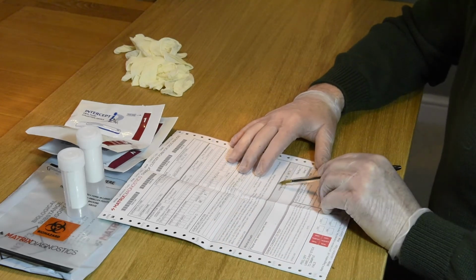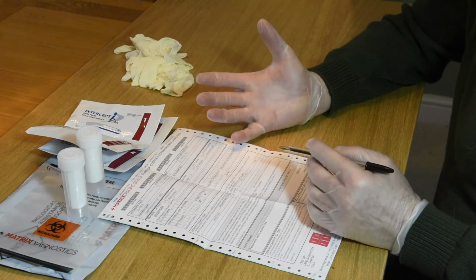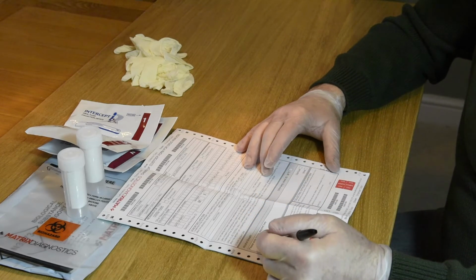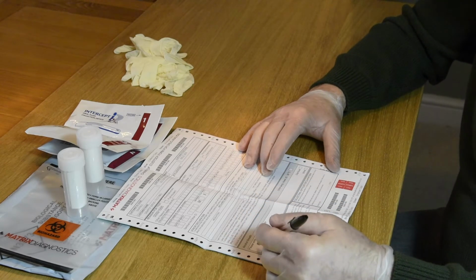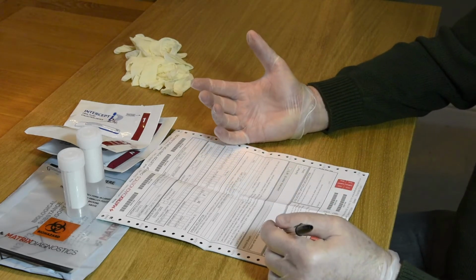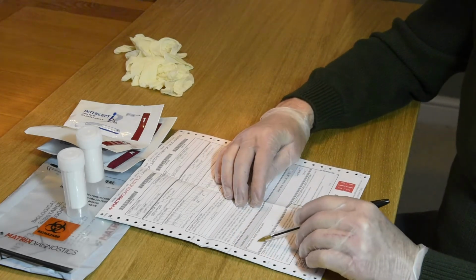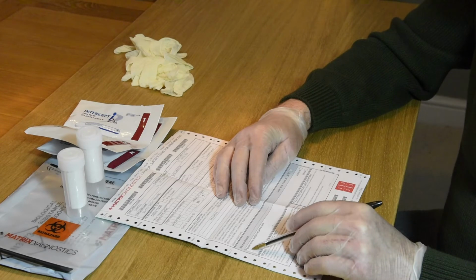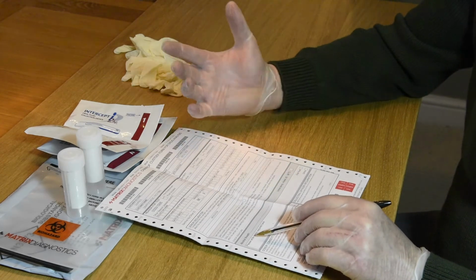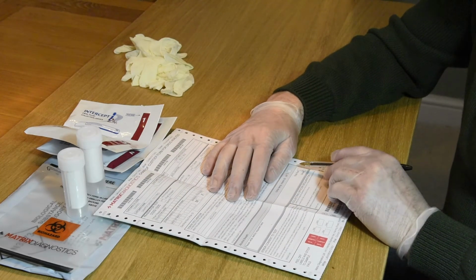Underneath that, if it's a urine test, you would put the little tick in the box for urine temperature, but we're doing oral fluid or saliva test here, so we don't need to worry about that. Where it says please write test required here, this is what you want the laboratory to test for. So your employee could have failed for, say, cannabis and cocaine, and if that's the case, you would simply write those two drugs there. You can either use the full drug name, or you can use the internationally recognised drug code, which you find on the drug kits. And then you just tick the box to say that it's oral fluid.